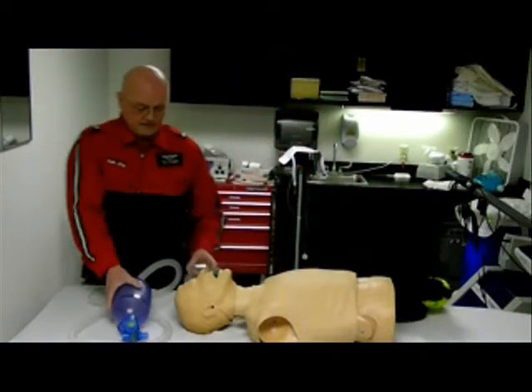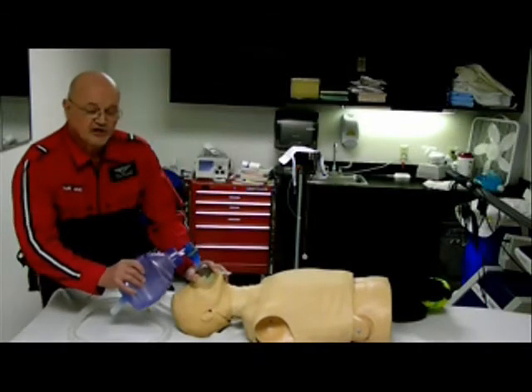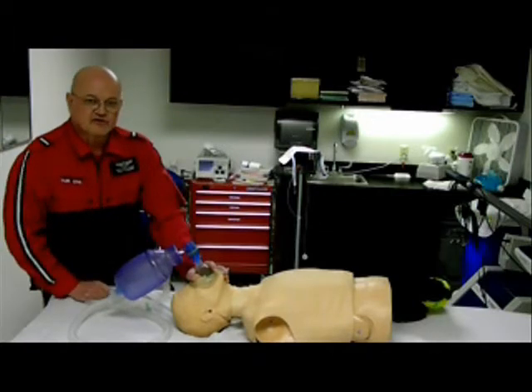When we're ready to ventilate, we want to use the CE method. Ventilate, watch for chest rise. Make sure there's no gastric distension.